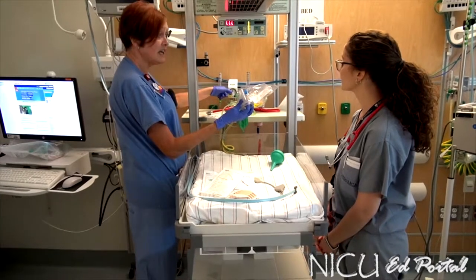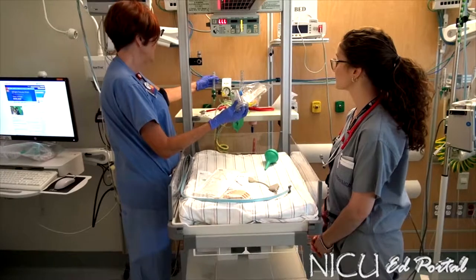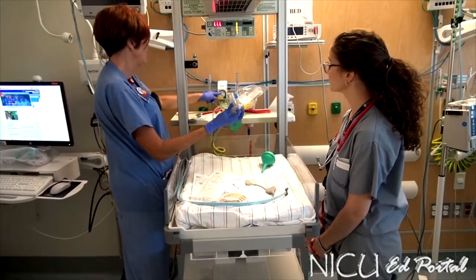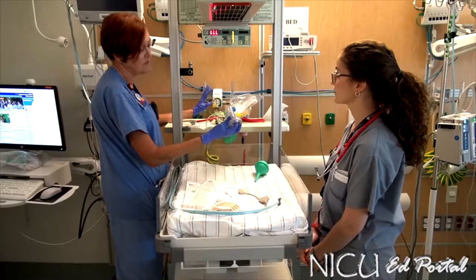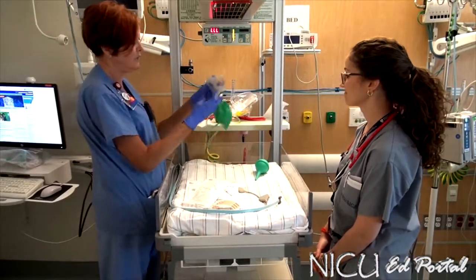The majority of our babies are resuscitated at room air. Even though you have the oxygen on — right now we're at 60% — you're going to take that all the way back down to 21%, which is room air. Babies will get resuscitated at 21%. There is a difference dependent on gestational age, but for now let's go with 21%.